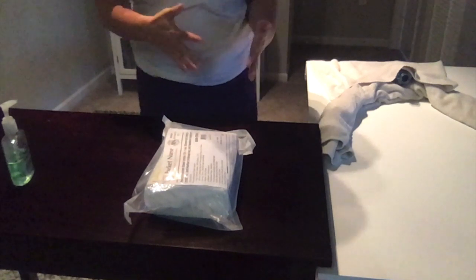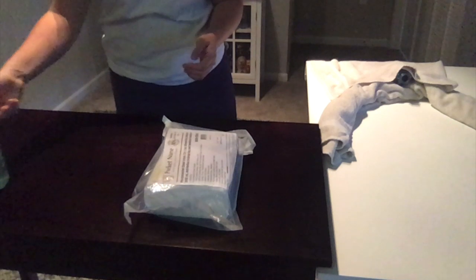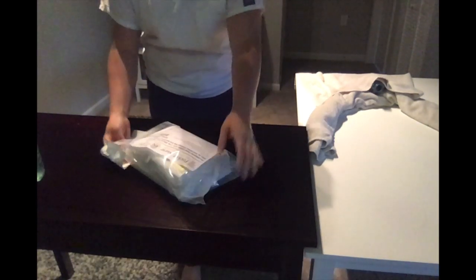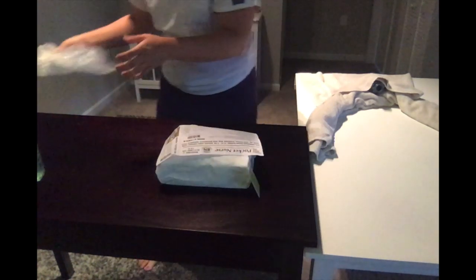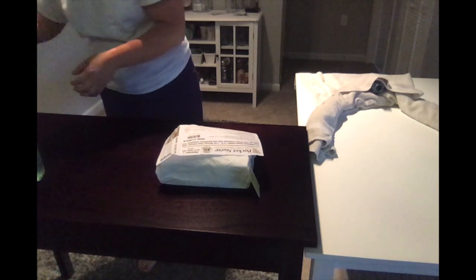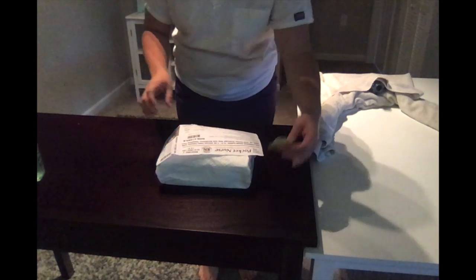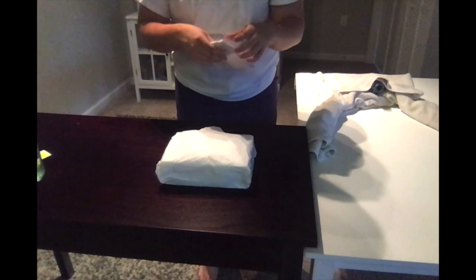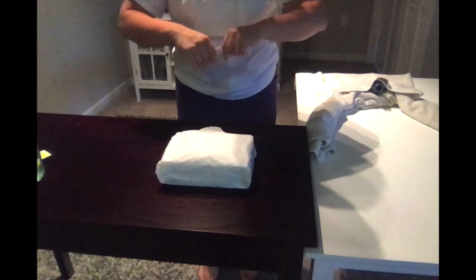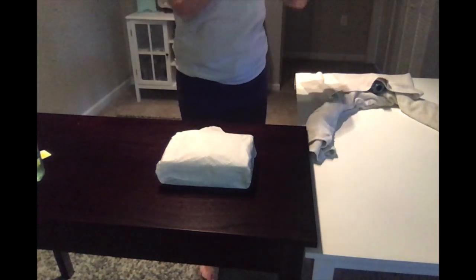After I've done pericare and removed my gloves, I'm going to go ahead and wash my hands again. And I can open my catheter kit. So I can open this up and put that in the trash over there. You're going to want to make sure that everything is to waist level. I'm going to save this wrapper so I can remember what size catheter it is. And I'm going to open my kit.